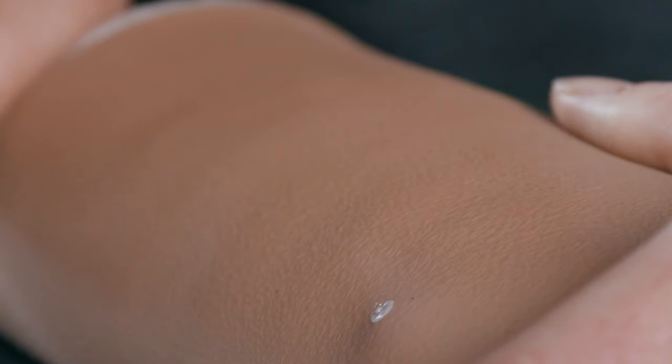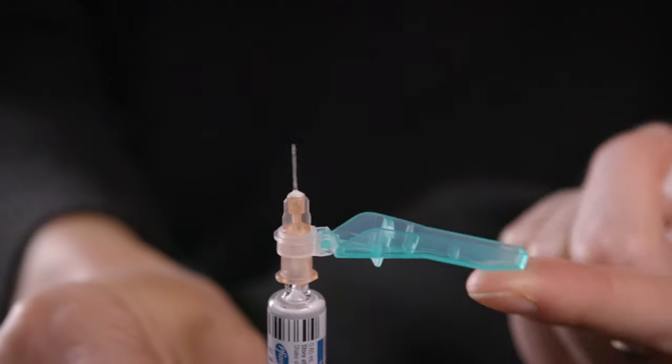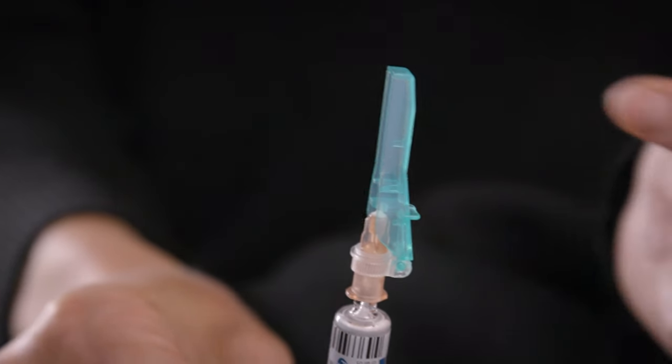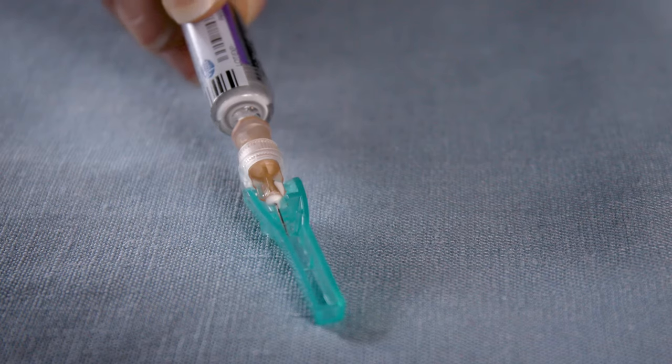Once all of the medicine is injected, remove the needle from your skin and cover the needle using the safety shield by pushing the shield up, then pressing it to a hard surface until you hear a click.